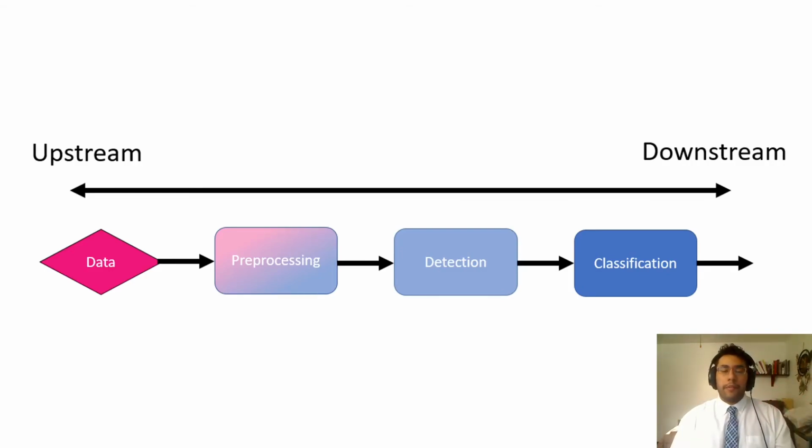Before I begin talking about DICOM files, that was a lot of workflow and a lot of information. What we're starting with essentially is the data, the raw material. This is considered upstream for us. Downstream is really the outputs like visualization, graphs, the image itself, location information of some abnormality.